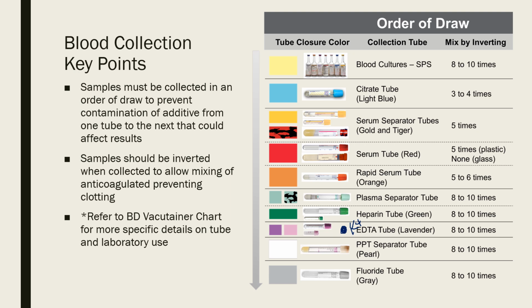So as soon as you do your venipuncture and you're switching out your tubes to go from one tube to the next, as you're pulling that tube off, you immediately want to do several inversions and place that tube down. As you're moving your arm to place that tube down, secure that tube somewhere so that it doesn't roll off and drop. Then you're mixing that tube as you're reaching for your next tube. So as you're swapping those out, if you keep in mind to mix those tubes as you swap them out, it's going to kind of help you.